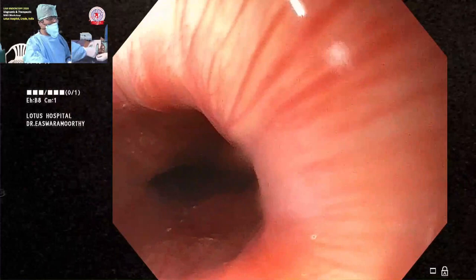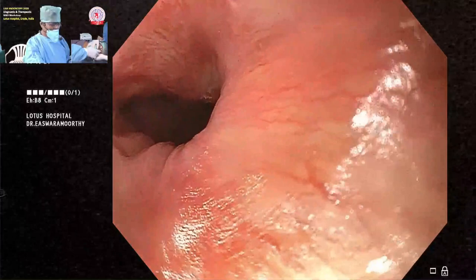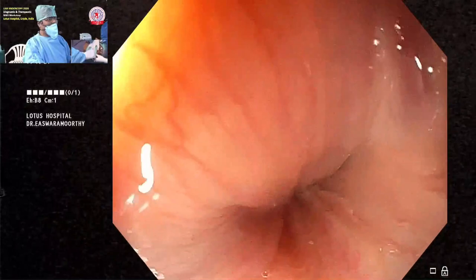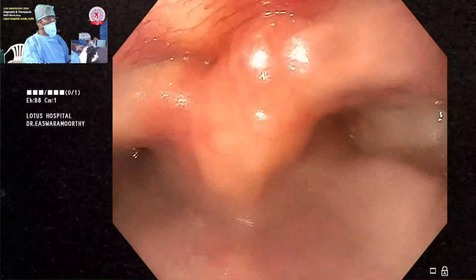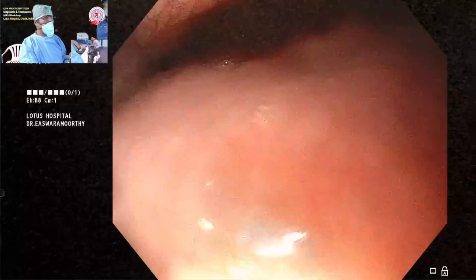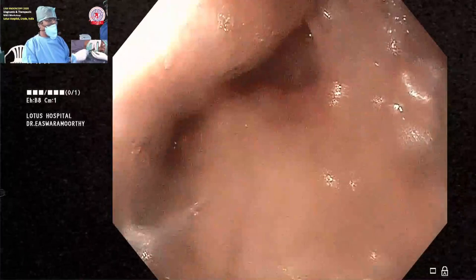Instruct your staff nurse: if you move your hand from the mouth position to the shaft, she holds the scope to maintain control. As you reach the 15 cm mark, you are at the cricopharynx — big wheel toward you again to visualize it. You will see the vocal cords again; take note of pyriform fossa and vallecula — do not leave these for ENT colleagues to diagnose. Aspirate any residual fluid; the uvula appears like a polyp at six o'clock — do not remove it. Come out without examining the teeth.